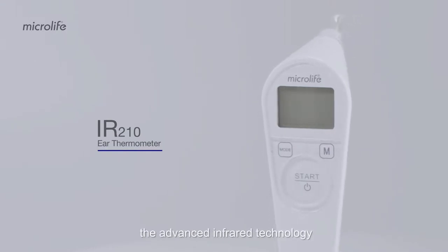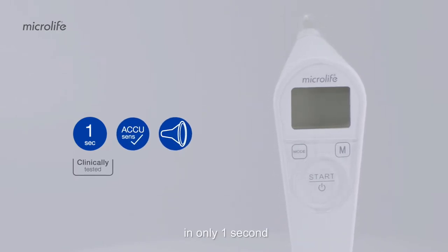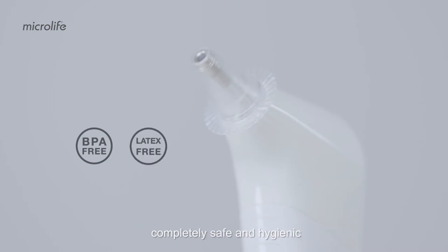The advanced infrared technology with the AcuSense guidance system enables accurate temperature readings in only one second. The disposable probe covers make the IR-210 completely safe and hygienic.